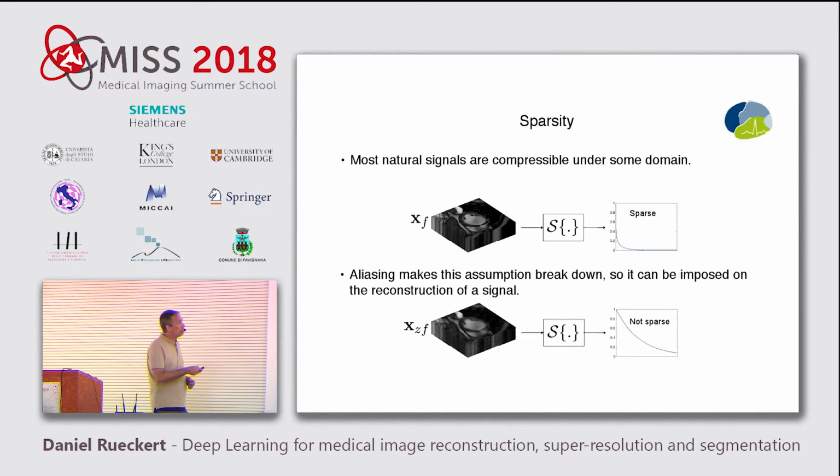And the most common approach for using this sparsity transform is to use, for example, something like a wavelet transform. I basically put this image through a wavelet transform, then I can discard most of the wavelet coefficients. And actually, this is what you're typically using every day if you're using wavelet-based, or DCT-based, JPEG compression, for example. It's basically the idea of compression. I can compress my image very efficiently using these models.